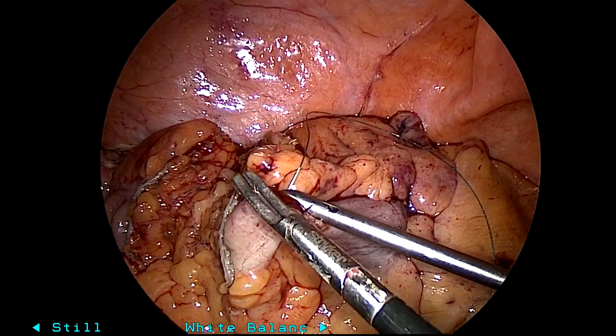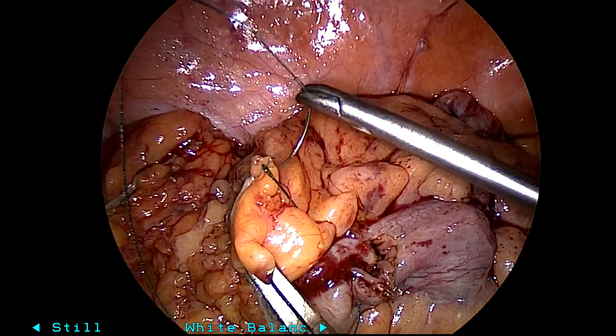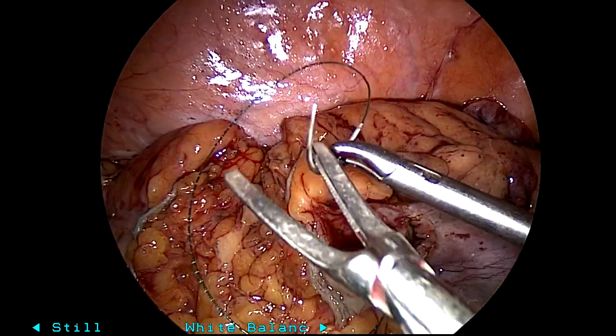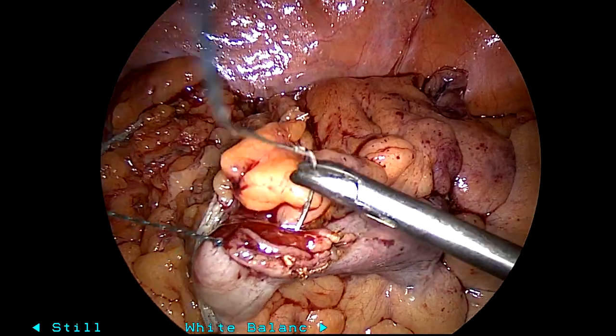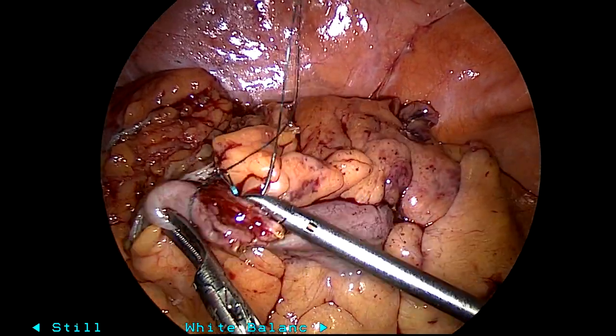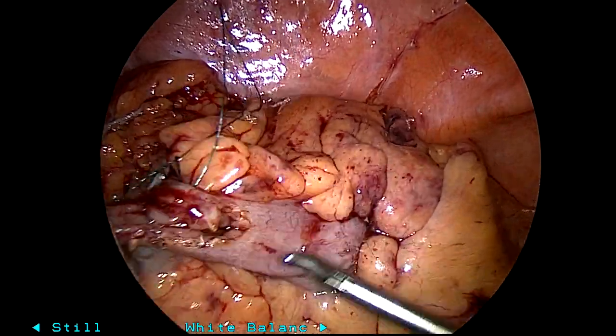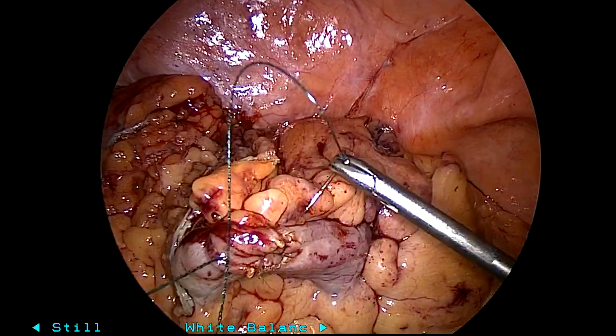I don't always do this, but in cancer cases I think it's worthwhile — I close this colotomy just so that when you're pulling your specimen through, you don't spill any stool or theoretically tumor cells. So I'm just doing that here. You can make the argument that this doesn't need to be done and you don't need to use V-lock. I was just trying to be expeditious.